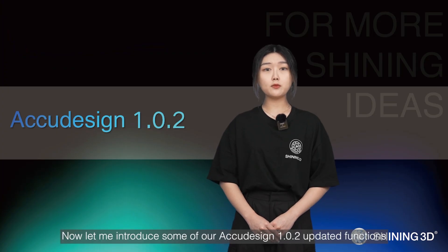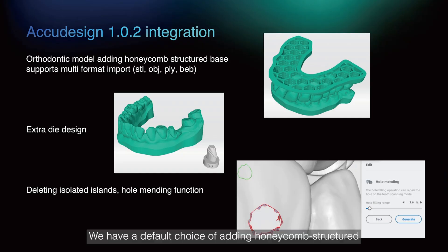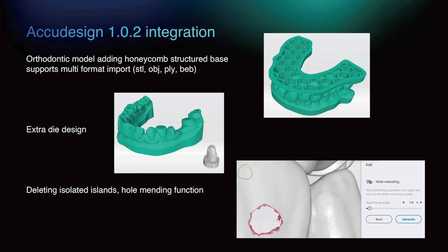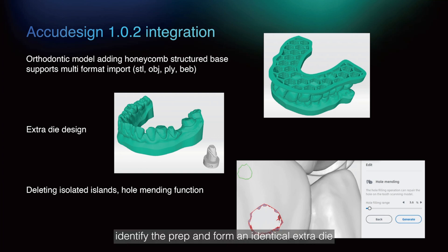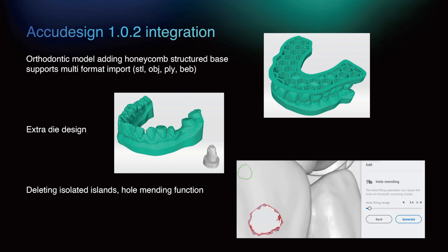Now let me introduce some of the AccuDesign 1.0.2 updated functions. We have a default choice of adding a honeycomb structured base on orthodontic models, and it also supports multi-format import. AccuDesign will automatically identify the prep form and identify extra dies for dentists to have an easier view of the margin line. You can see this from the picture on the right.